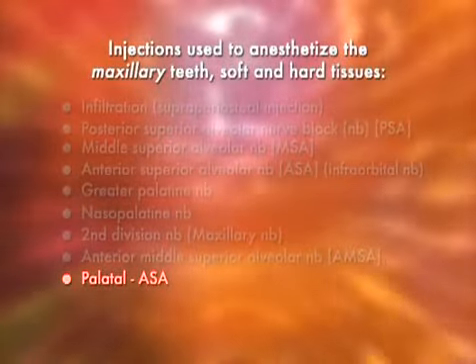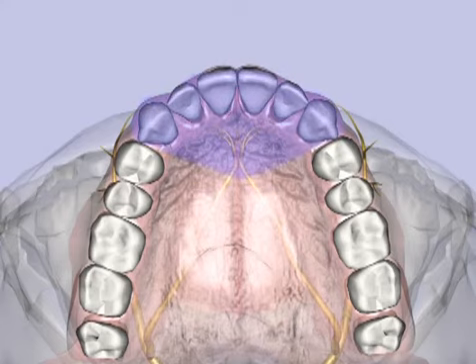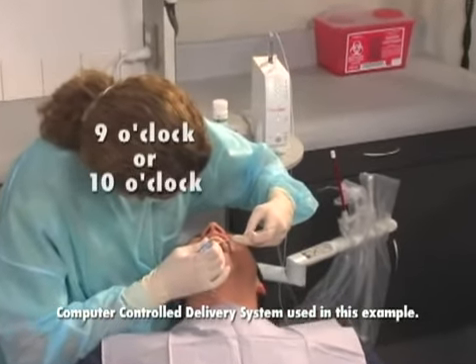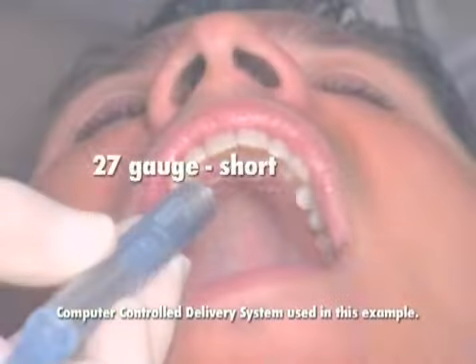The palatal approach to the anterior superior alveolar nerve block, also called the PASA, provides pulpal anesthesia bilaterally to the maxillary incisors and to a lesser degree the maxillary canines, as well as the labial and palatal soft and hard tissues of these teeth. For the PASA nerve block, sit at the 9 or 10 o'clock position, facing in the same direction as the patient. A 27-gauge short needle is recommended.